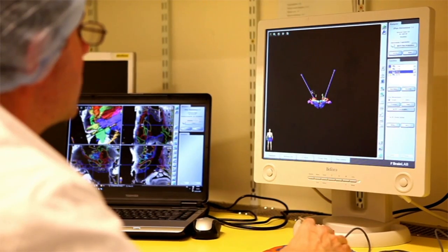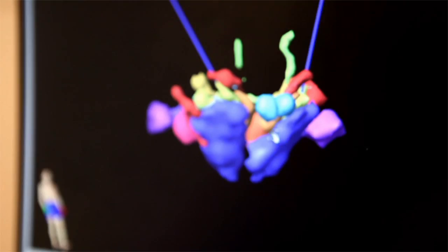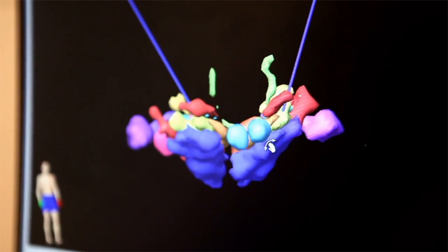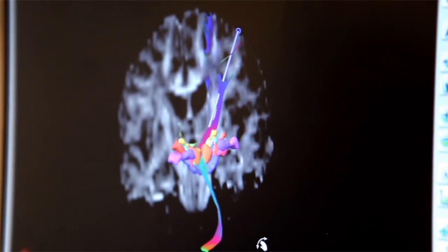Now we plan the trajectory in order to reach the region of interest. We analyze this region and place the electrode in the correct place.